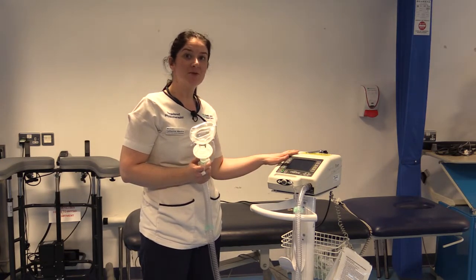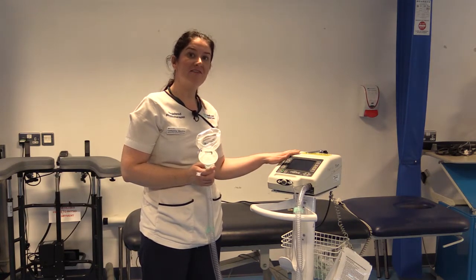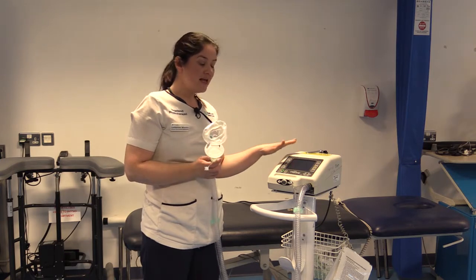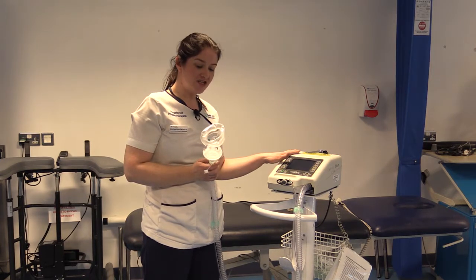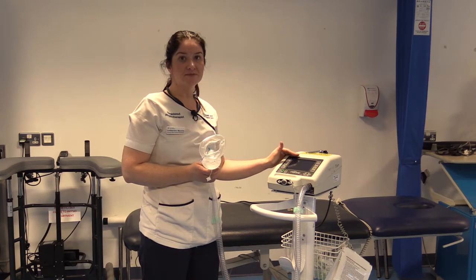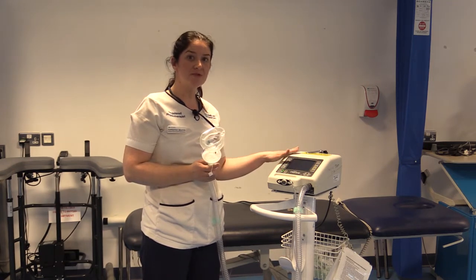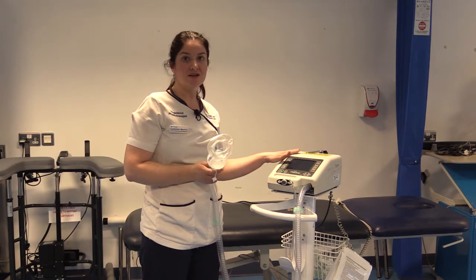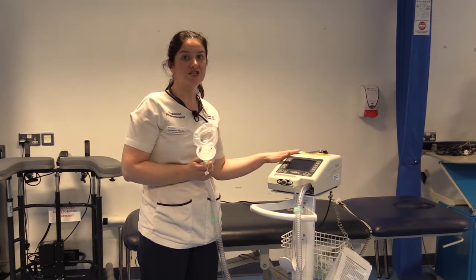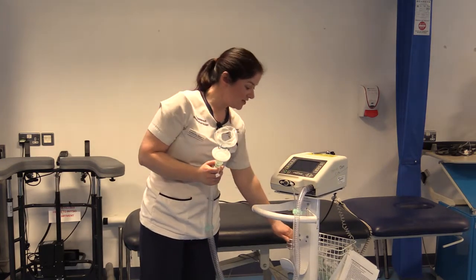Now we're going to talk about the cough assist called the Nippy Clearway. The main difference between this and the Emerson is that you can entrain oxygen through this machine. For patients with a higher oxygen requirement, this is going to be the more suitable cough assist of choice. When attaching oxygen, make sure the machine is turned on first, then the oxygen is turned on. The oxygen is turned off first, and then the machine is turned off. This is because there is an electrical risk and fire hazard — it is very important that oxygen is never running when the machine switch is turned off.